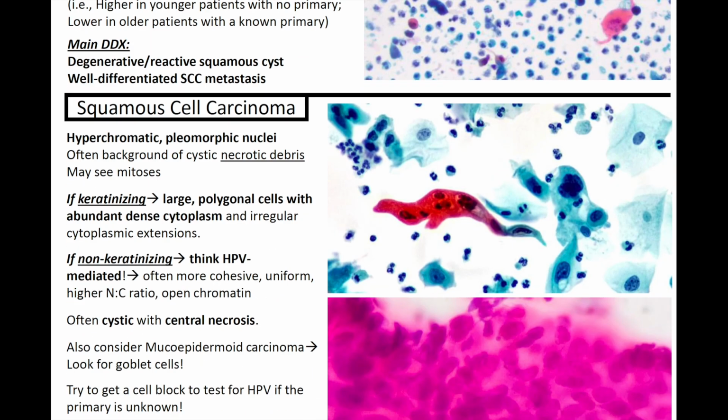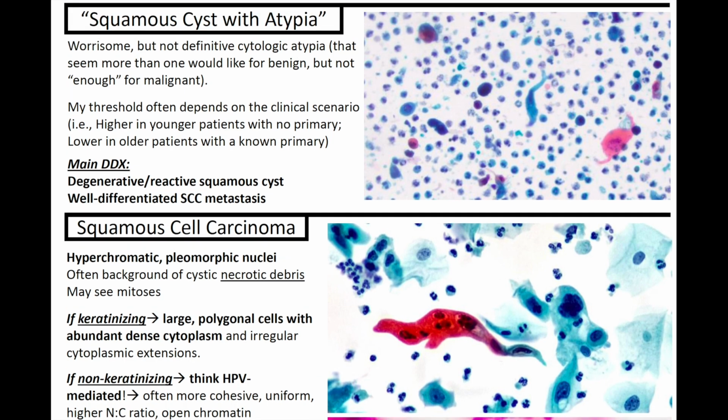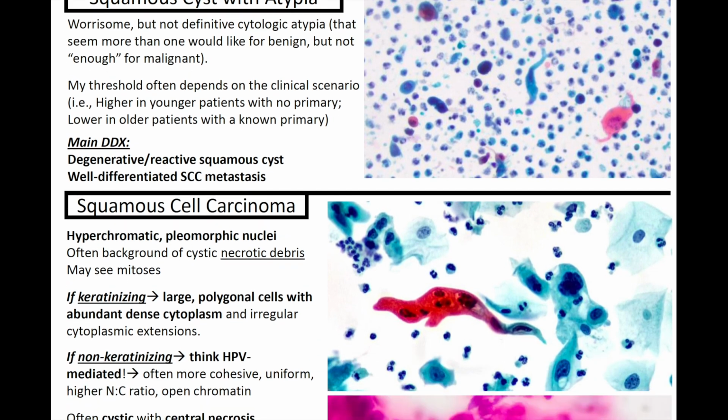Moving on, we have squamous cell carcinoma. Oh, I'm sorry, not yet. Actually, we have squamous cyst with atypia.